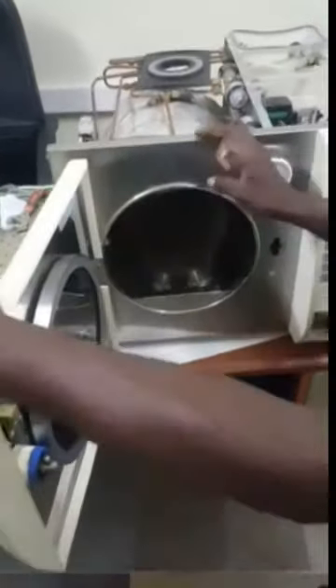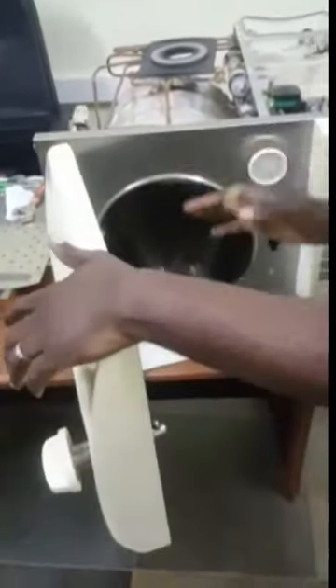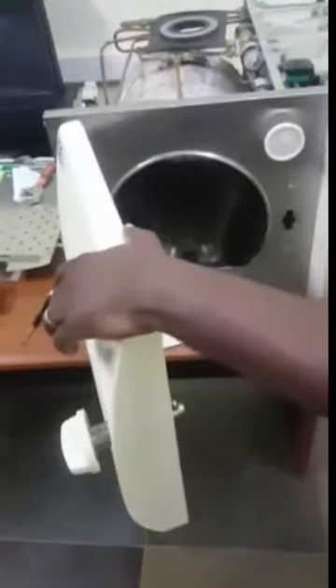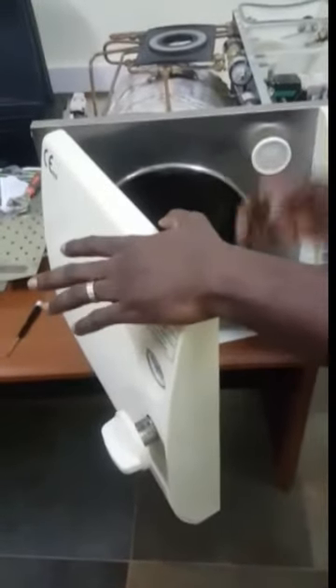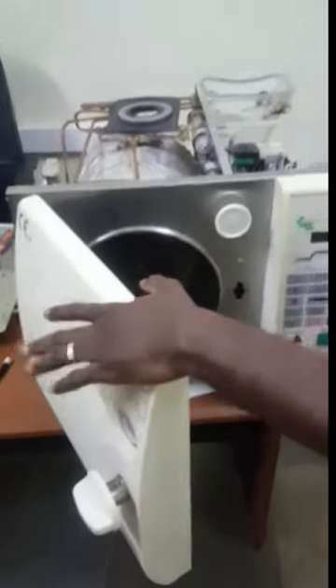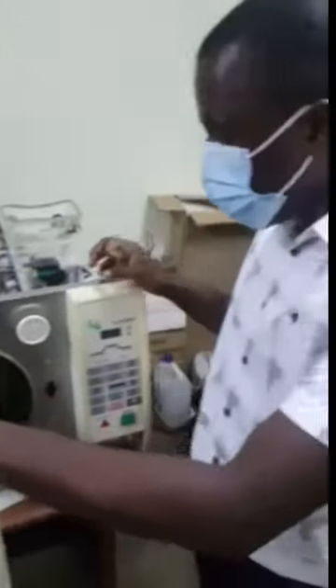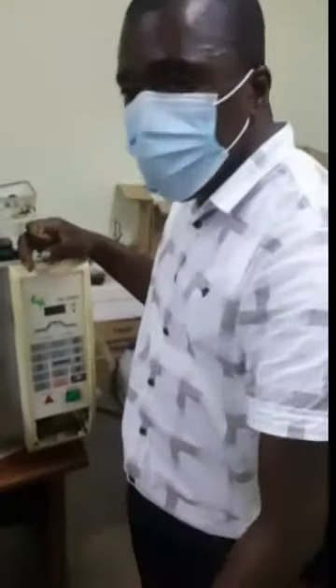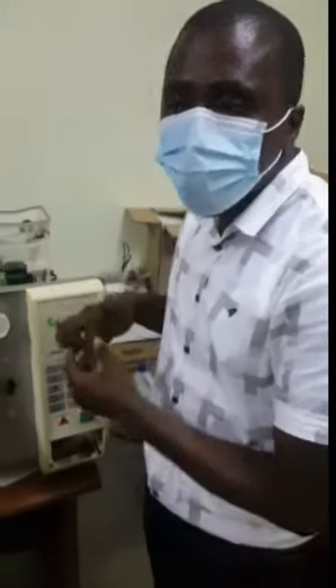After doing this, we use the descaling agent for cleaning of the chamber. After using the descaling agent, you run the cycle two more times to make sure that all particles of the agent in the system are properly removed. Then the device is ready for use.